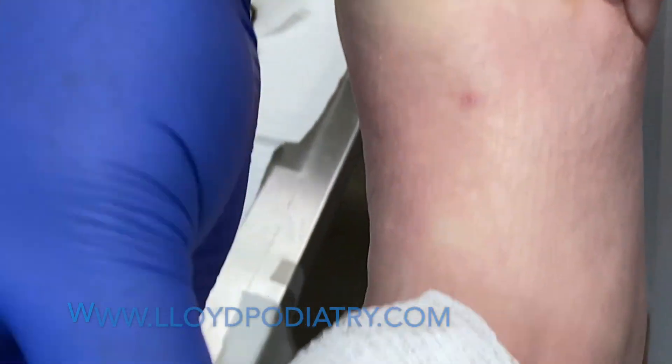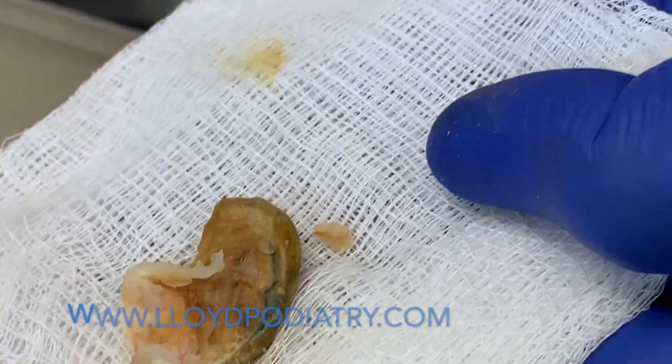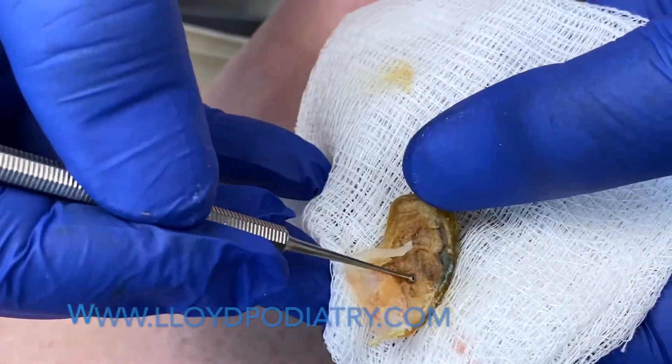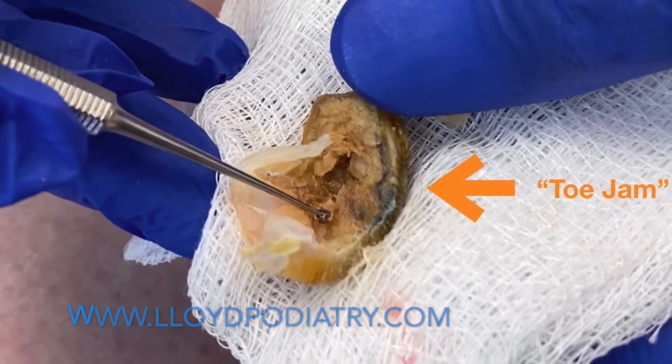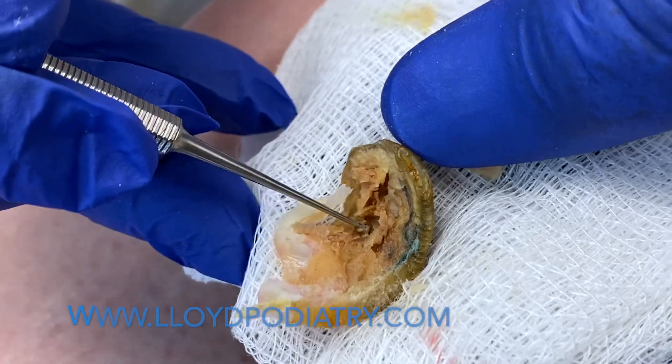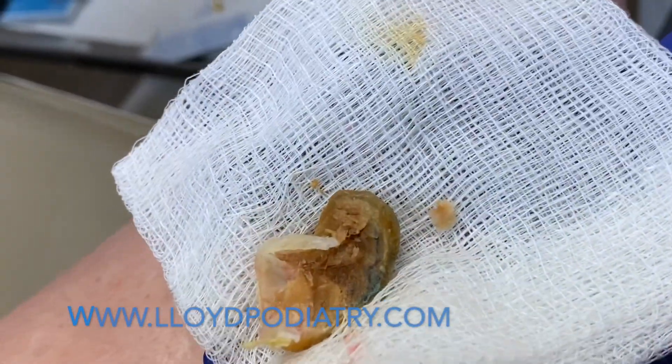You can see how much of that nail is diseased underneath there. This is where the smell is coming into the room from the infection. Look at this — terrible. But this is why she's here, to get rid of this.